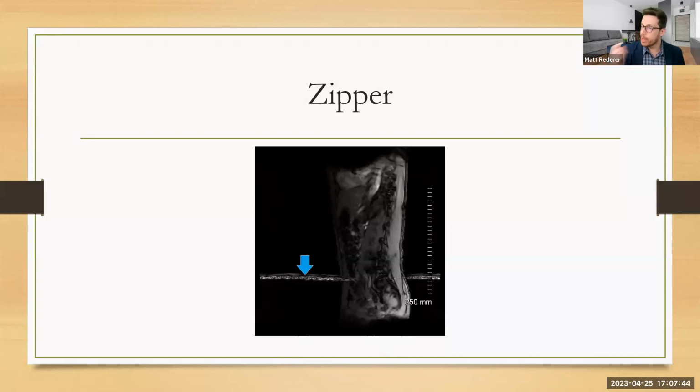I caused this. I went in my room and started making phone calls with the door open as we were acquiring images, and this is what we got. It was broadcasting RF in the room, and we were picking it up as this streaking across our image, this false information. The system can't tell the difference between radio frequencies from our patient or radio frequencies from something external.